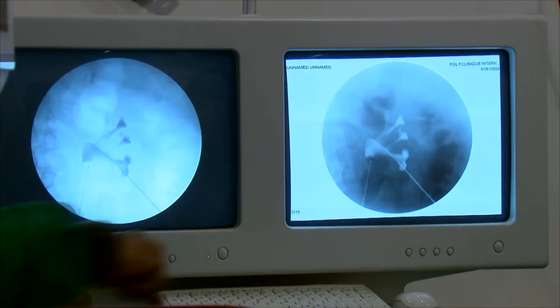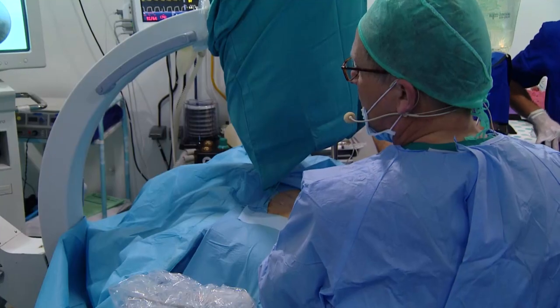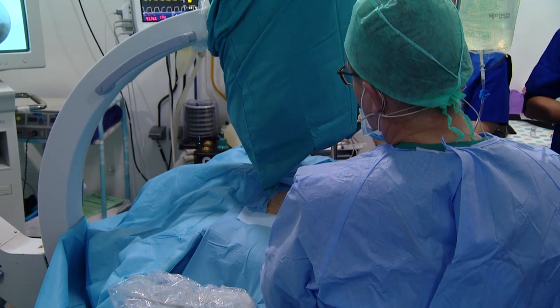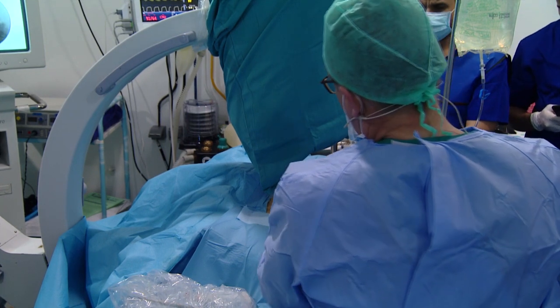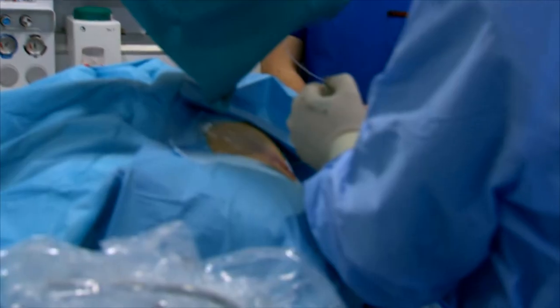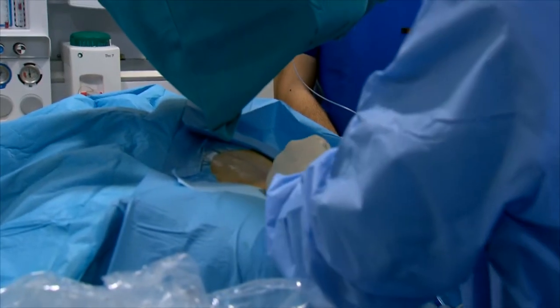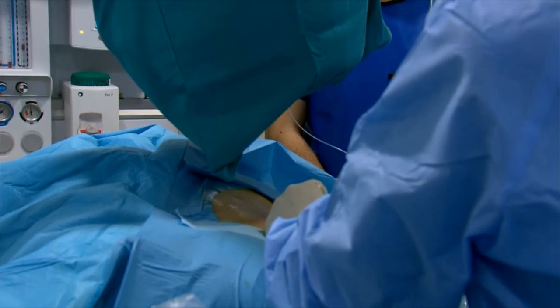Now we are removing the needle. Is it possible to show this by camera? Okay, we are removing the puncture needle. Leave the view on the image intensifier. This is to check if we are correct. But we are correct, it is blue, it's okay. Now we are removing the needle. Thank you. And inserting the dilator.